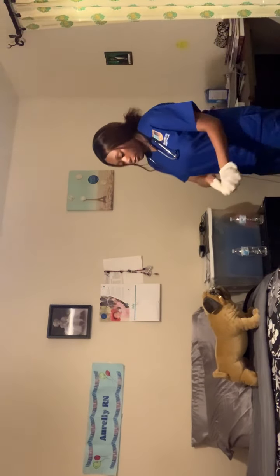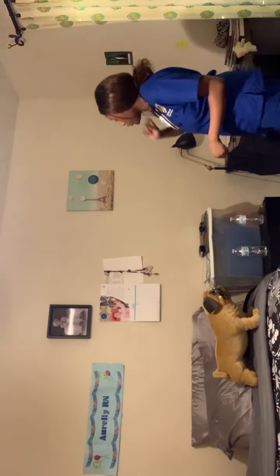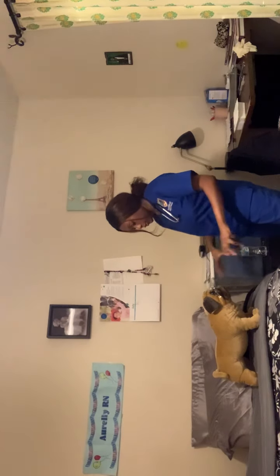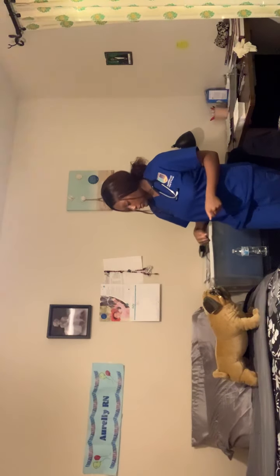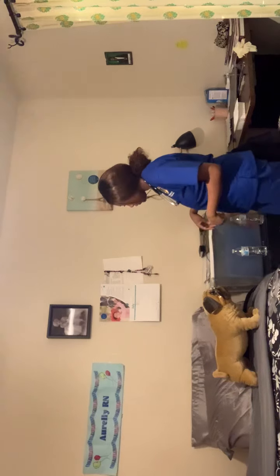I would then throw away my gloves. I would perform hand hygiene. I would raise her side rail. I would lower her bed to lowest level, make sure it locks. I would put her call light within reach. I would thank the patient, perform hand hygiene, and go document.